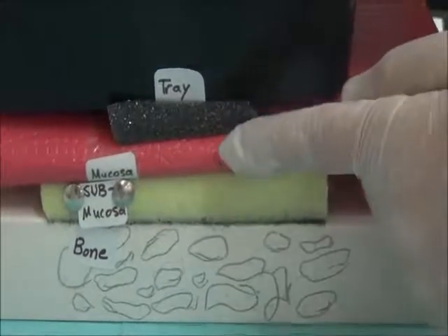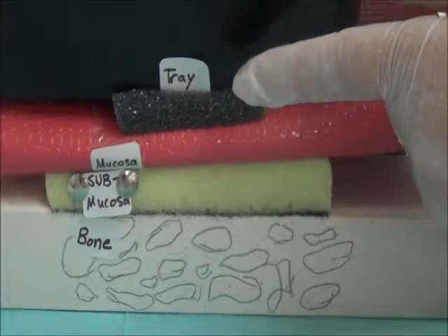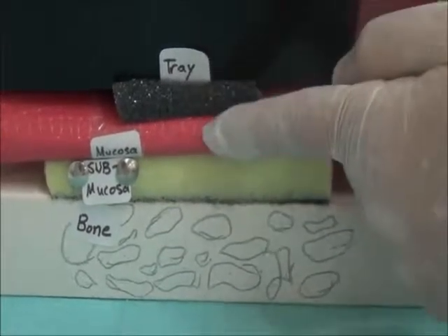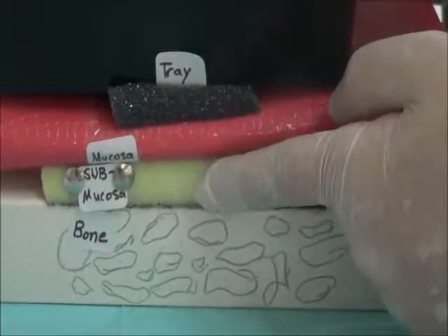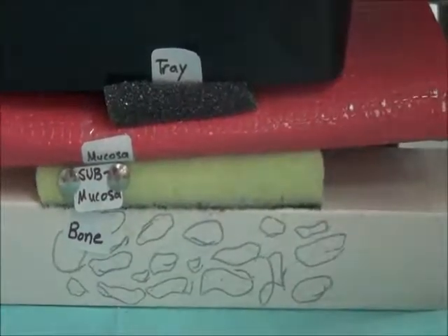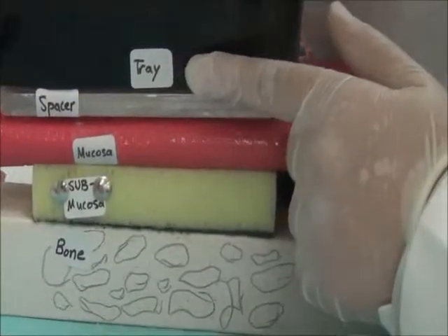This can be once more done with a tray that has no spacer in that area. The impression material is squeezed between the tray and the mucosa. The mucosa has some compressibility, and the bone itself could withstand such pressure. What happens in the case of the presence of the spacer?